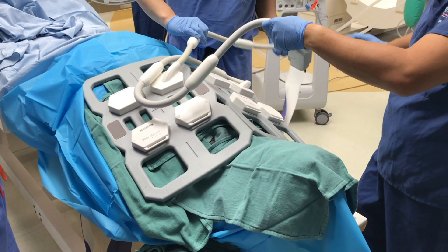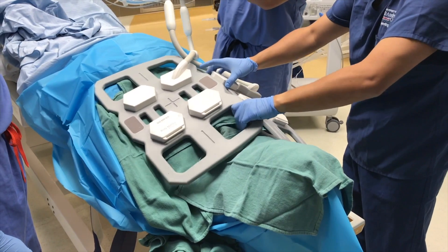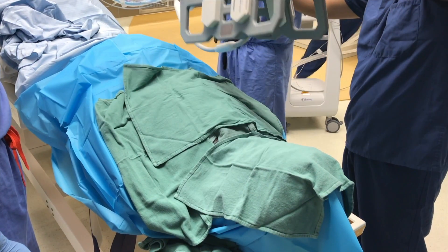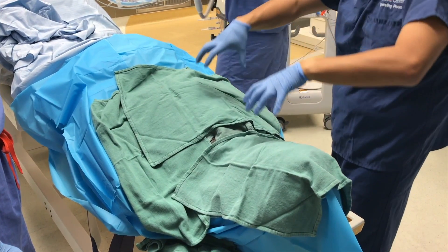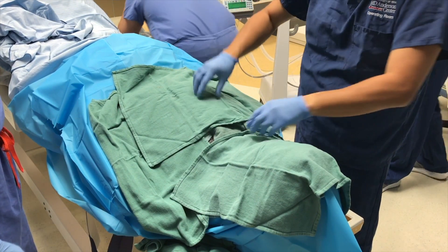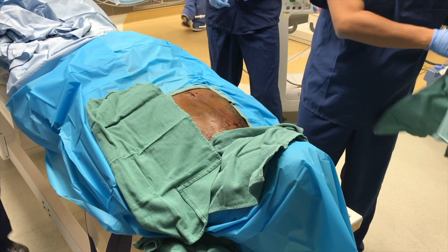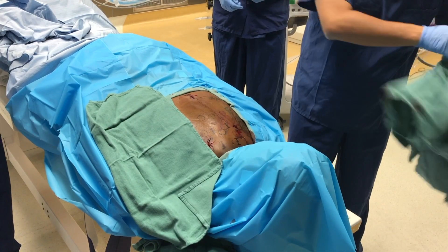The wounds are closed and dressed. We keep patients on a short steroid taper to prophylax against post-treatment tumor swelling and 24 hours of antibiotics against skin flora. Patients are ambulated on post-operative day one. We routinely obtain more comprehensive MR imaging in the days following surgery, and often will obtain myelography if needed for spinal SRS treatment planning.